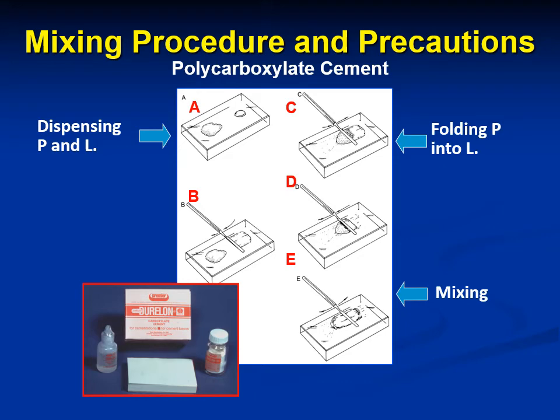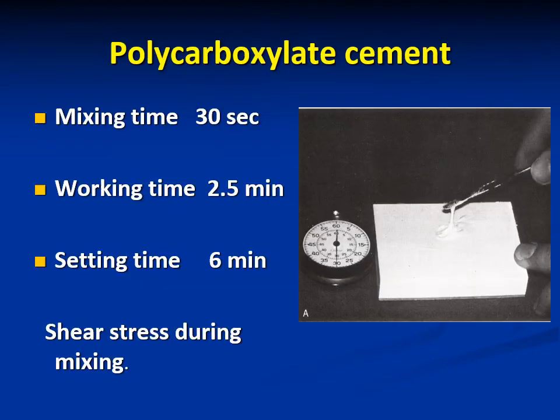The consistency, the working time is about 2.5 minutes with the mixing time of 30 seconds. And here we notice that the working time is much lower than that of the zinc phosphate cement.